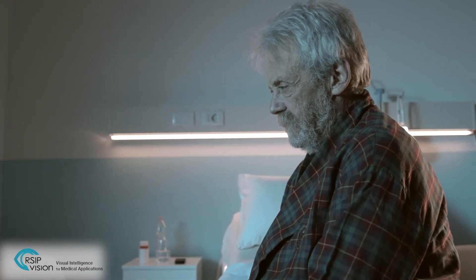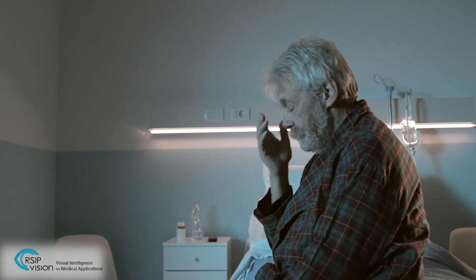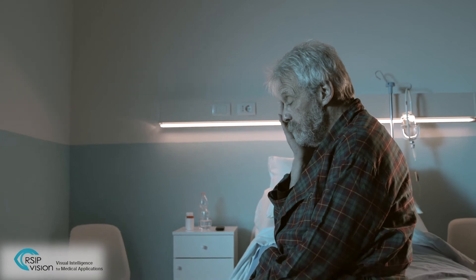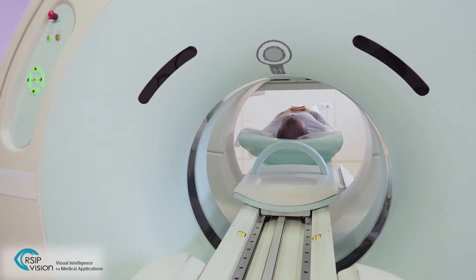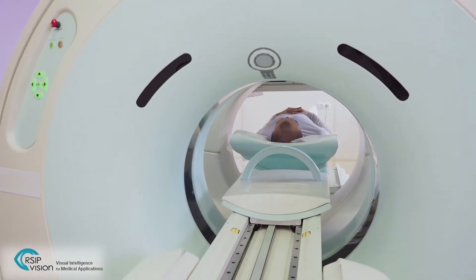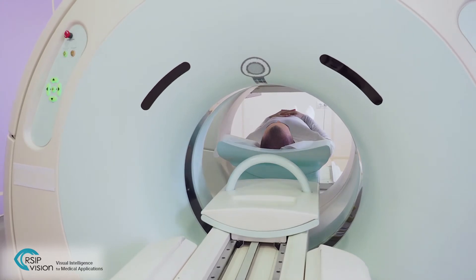Prostate cancer is the most common cancer in males, affecting nearly 10% of the population. An MRI scan is often used for prostate cancer diagnosis.